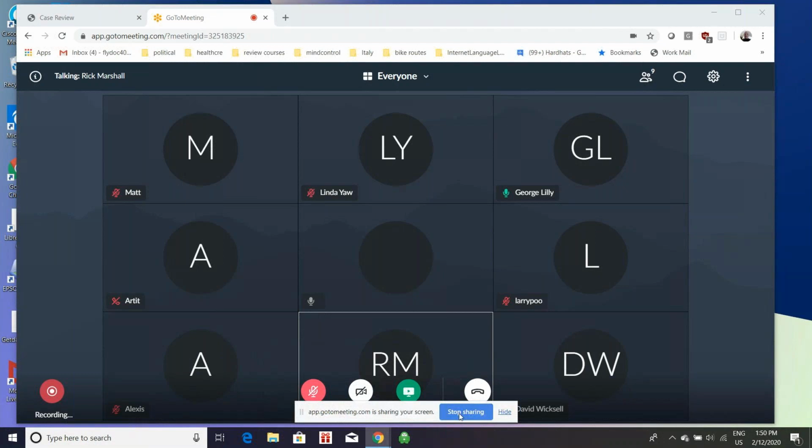Then we're also looking at a patch that will allow us to have multi-tenancy on the system. Once we can ascertain exactly who the user is, we know what patients they should be allowed to see, and they should be allowed to see patients from their VA site. I don't know if it's patch 6 or patch 7, but we're working on a patch to allow multi-tenancy, where multiple VA sites could use the same VAPALS server to enter patients into it and to support their VA site. So depending on who you were, you would only get to see patients that were for your VA site.